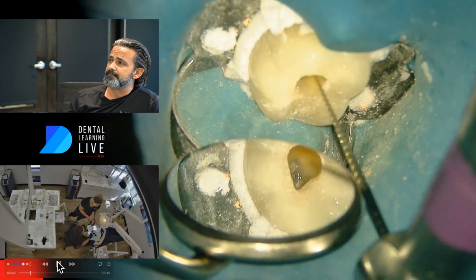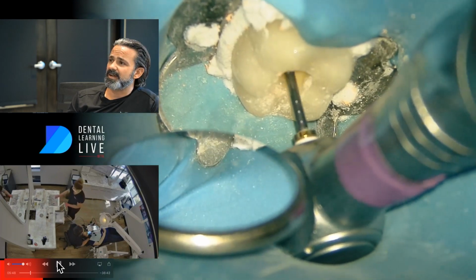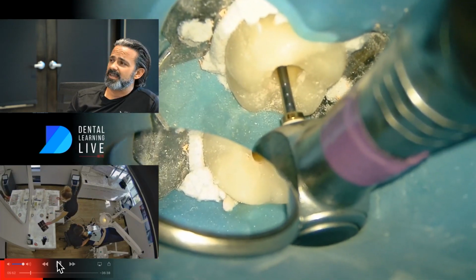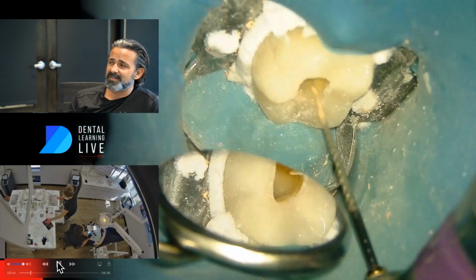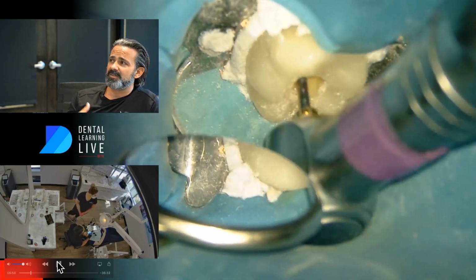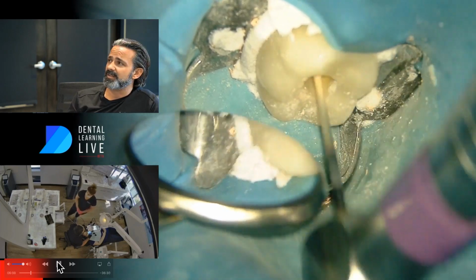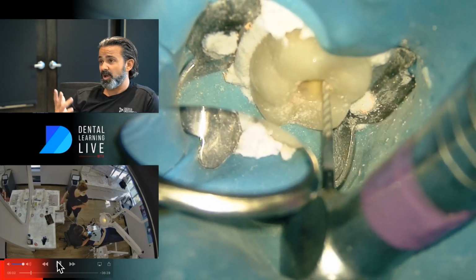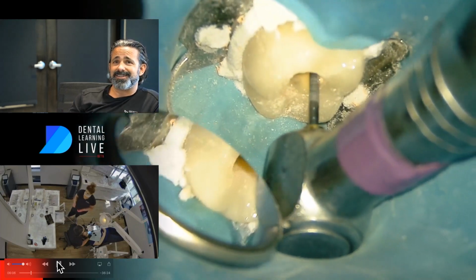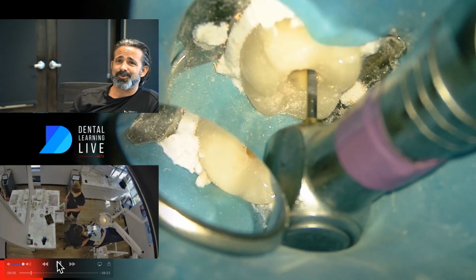So once I get that softened up, I'll just go back. This is my 1506, and it's not terribly stiff, and I'm just trying to work it in the C-form as I'm working in through the gutta percha. So that's all I'm doing right now. I know it's terribly fascinating to pick a gutta percha and watch it, but that's what we're doing.